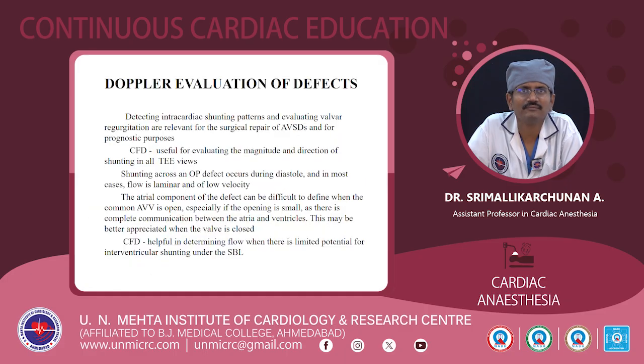And coming to the Doppler evaluation of defects, detecting intracardiac shunting patterns and evaluating valvular regurgitation are relevant for the surgical repair of the AVCD and for prognostic purposes. Color flow Doppler is useful for evaluating the magnitude and direction of shunting in all TE views.